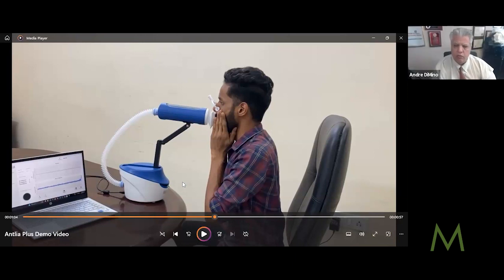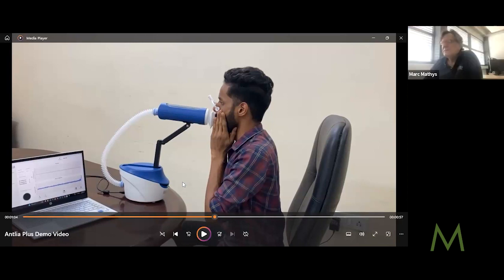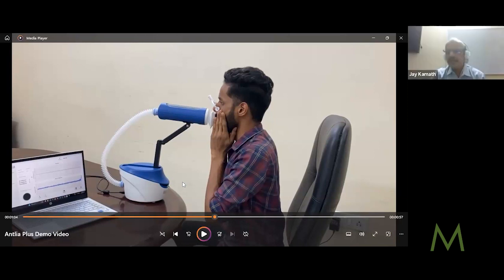Continue the video so we can see the waves again. So with the tidal breathing, are you instructing the patient to just be sure they breathe normally? Exactly. Okay, understood. Can you measure the lung volume? We are not measuring this. This is impedance based. So I'm sending sinusoidal waves and I measure the impedance, which has a resistance and a reactance part.